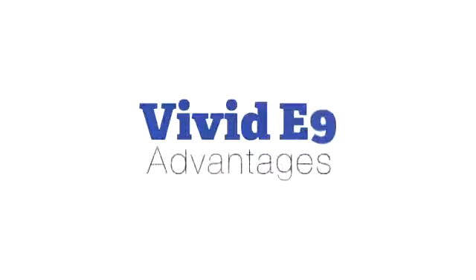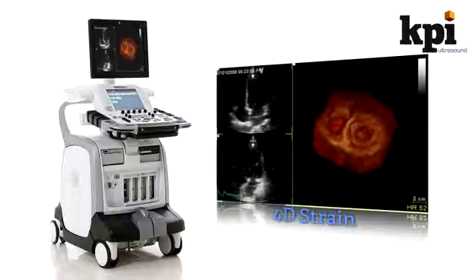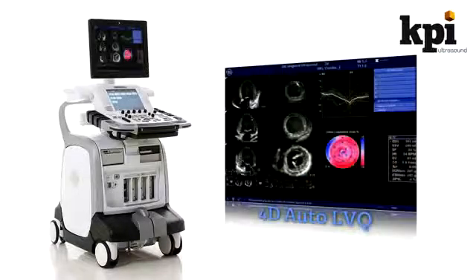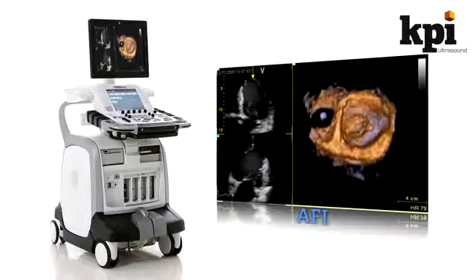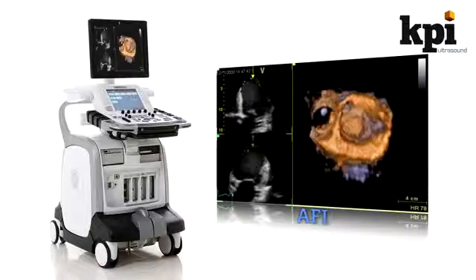The Vivid E9's advantages: The E9 focuses on cardiac 4D with new and system-unique tools like 4D strain, 4D stress, and 4D auto LVQ. More common cardiac tools like AFI for multi-plane and transesophageal imaging, intima-media thickness, and cue analysis are of course standard.